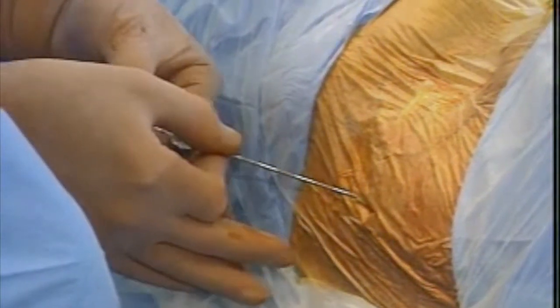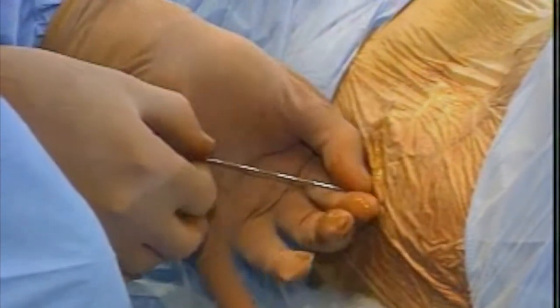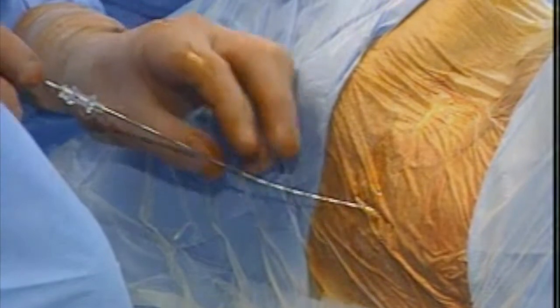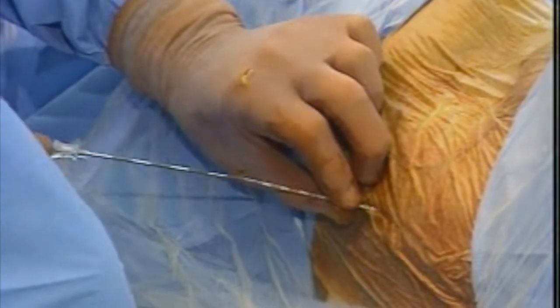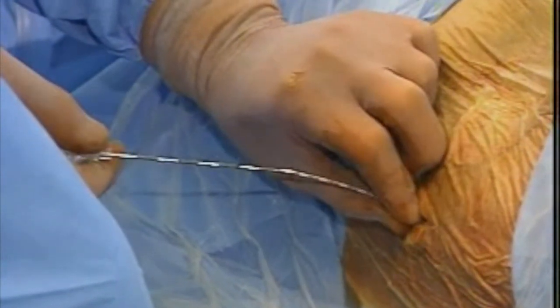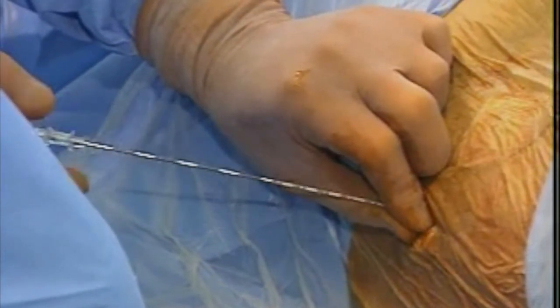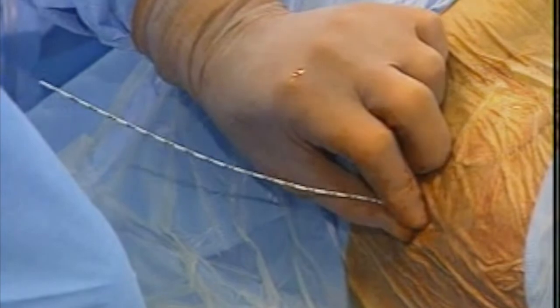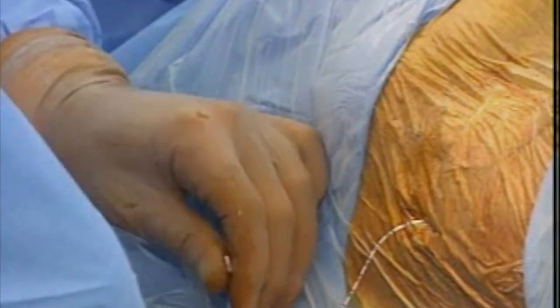Then grasp the catheter near the exit site and carefully slide the needle to the end of the distal catheter. While still holding the catheter close to the entry point, slowly withdraw the introducer needle and guide wire together. This prevents the needle tip from damaging the catheter during guide wire removal.